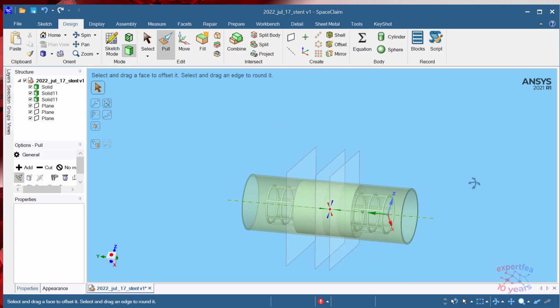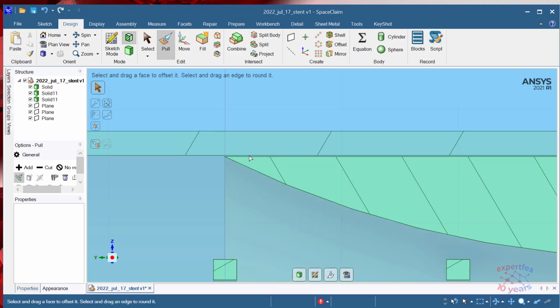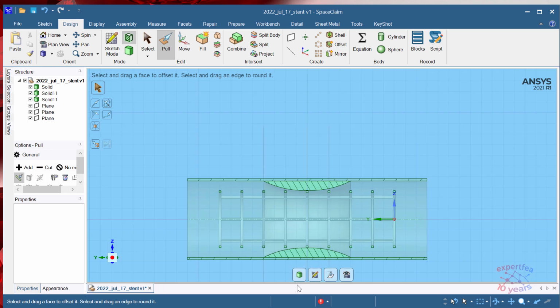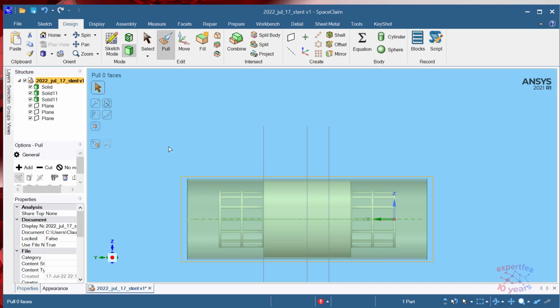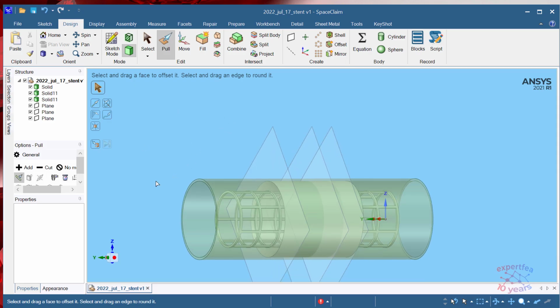Show wall. We're going in section view and we're looking here. So the gap is not the gap, this gap is more pronounced, let's say. Let's leave it like that. Yes, we have 3 parts, 1, 2, 3. Right click, source, internalize all. This is a very good command if we're using external parts or maybe borrowed, copied parts from other provenance. Let's save. Yeah, and I think that's all regarding the geometry.